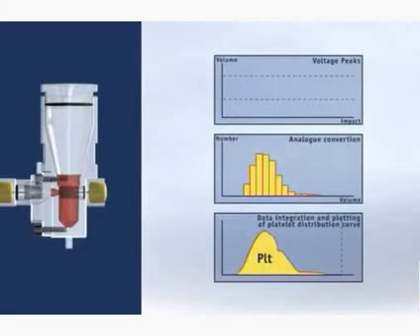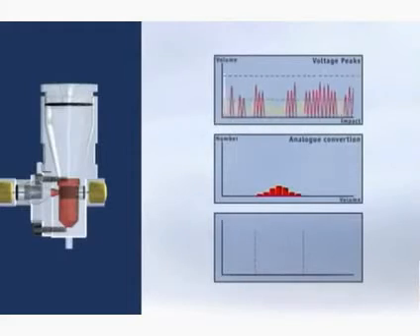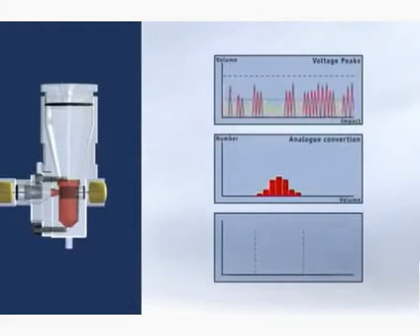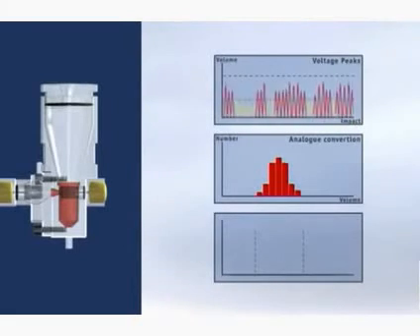So this is the count of platelets, and again here we can find the RBC count.